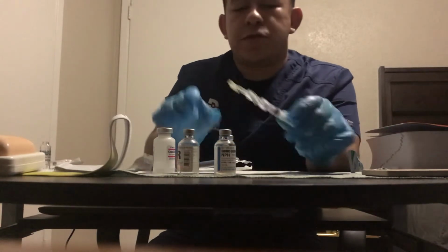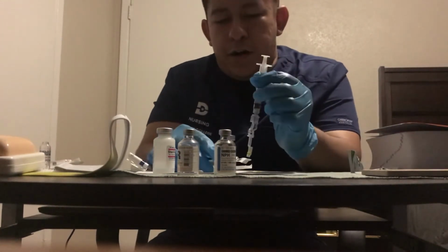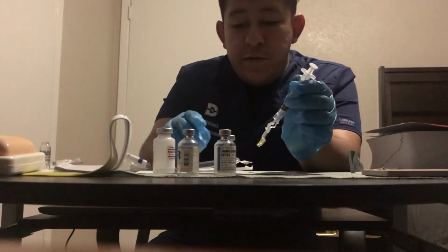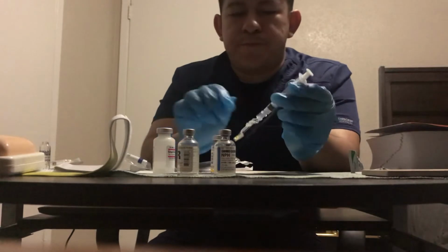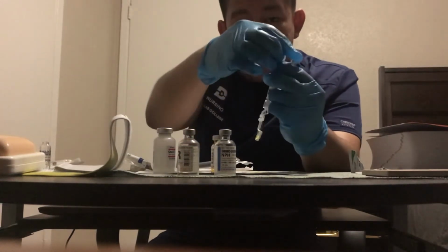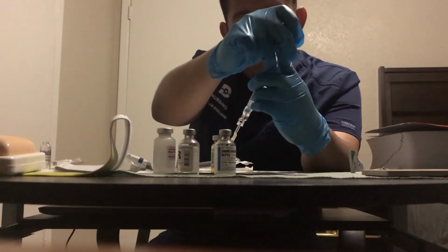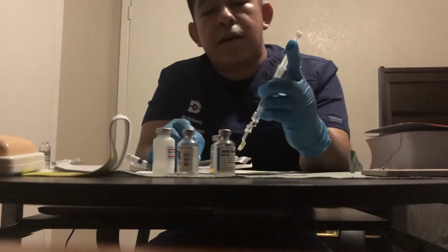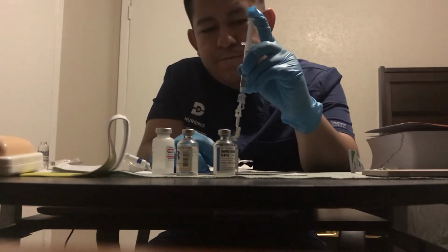we're going to go ahead and draw up our 2.5 mLs because that's what equals a gram and that's what is ordered. So you get 2.5 mLs of air, and then you inject your 2.5 mLs of air.